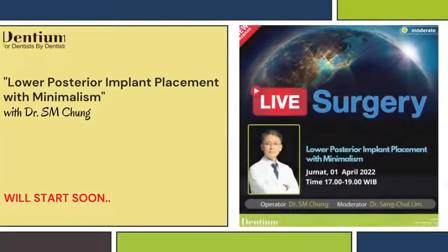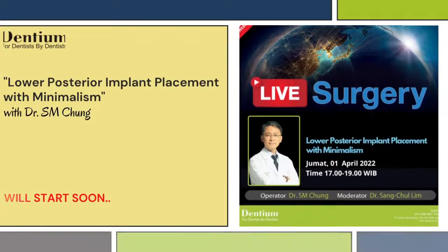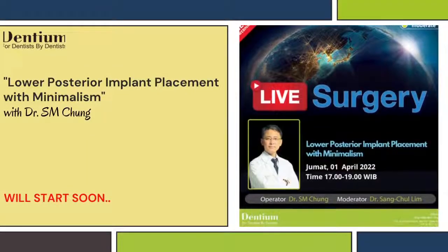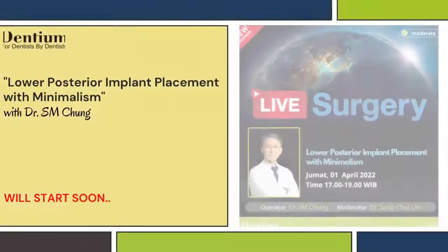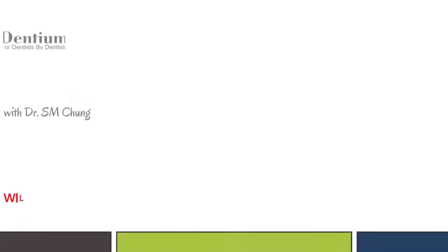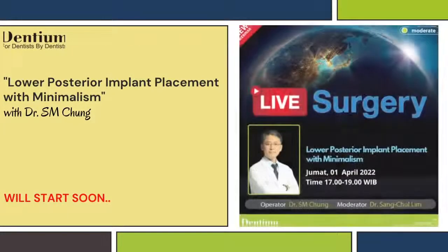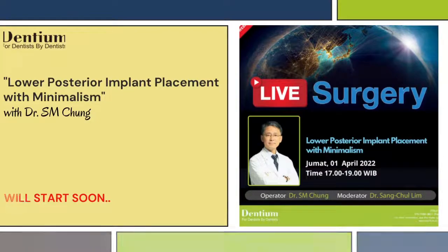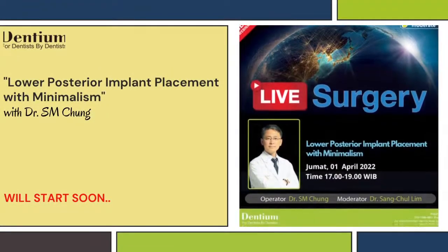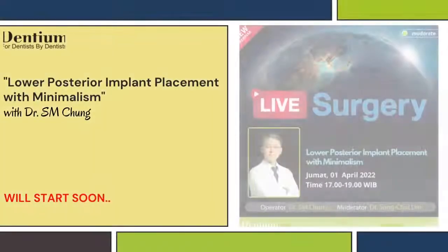Okay, this one is a similar case too. What do you think about this lower left area? Actually, lots of teeth are missing, so we need implant fixtures. This case needs minimally 2 implant fixtures to support a zirconia final restoration, number 5, 6 maybe.